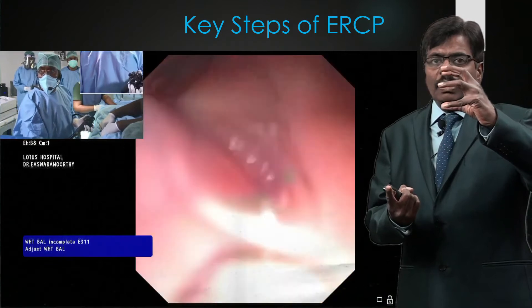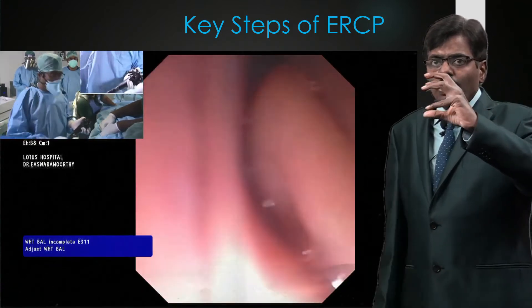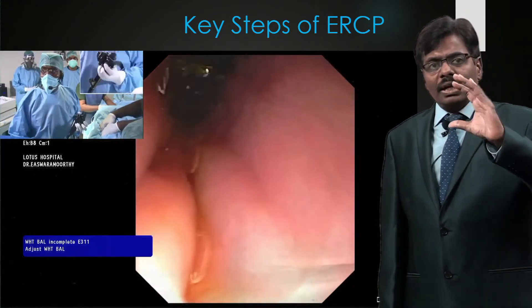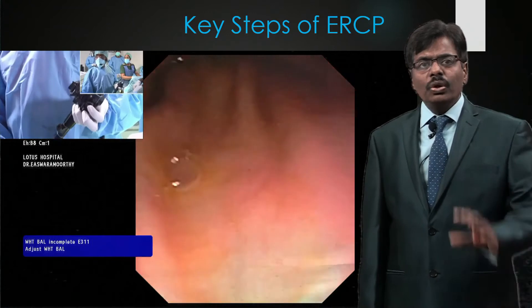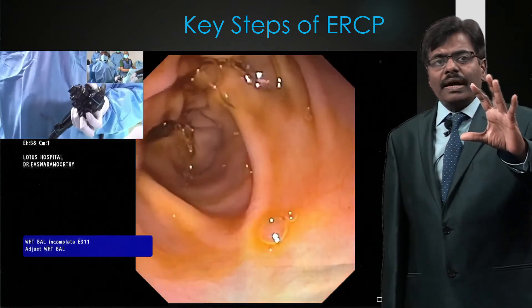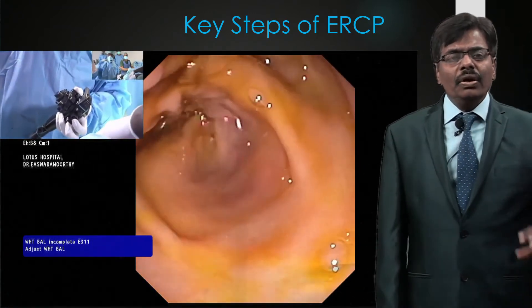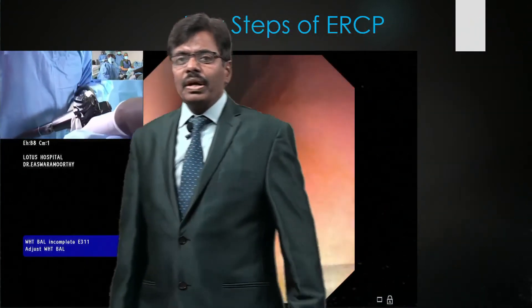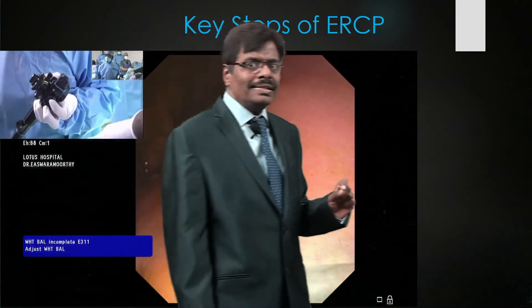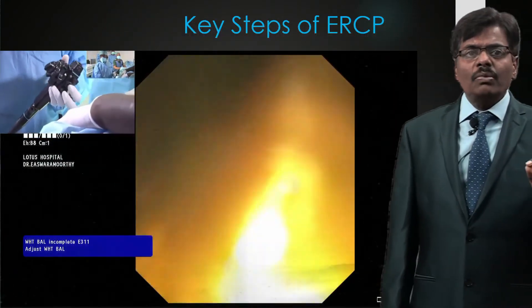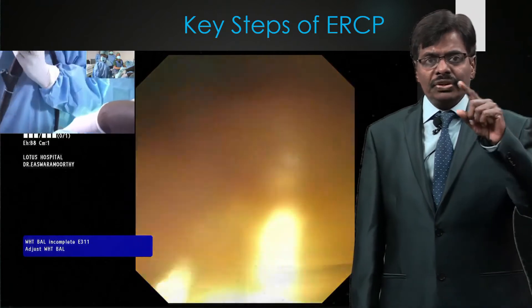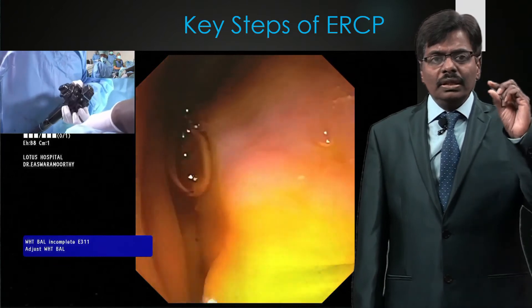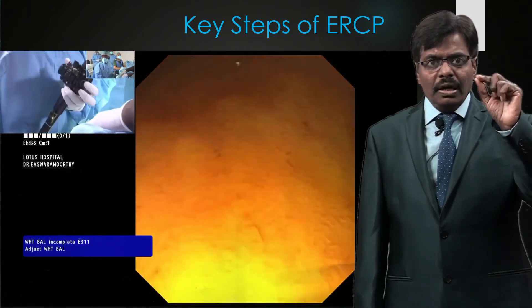With the big wheel away from you, the tip deflects one way; big wheel towards you takes it the other way. Going along the greater curvature — the long route — you can see the antrum, and we are approaching the pylorus. You will see what we call the sunset appearance: the pylorus appears at approximately the 6 o'clock position on the monitor — like a clock face — three-quarters visible and one quarter hidden.